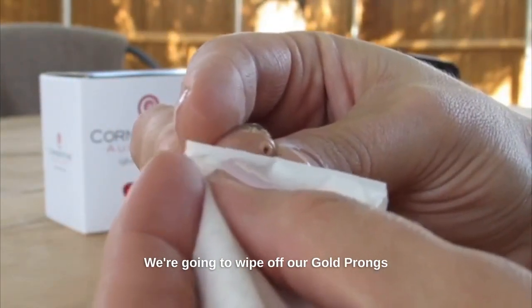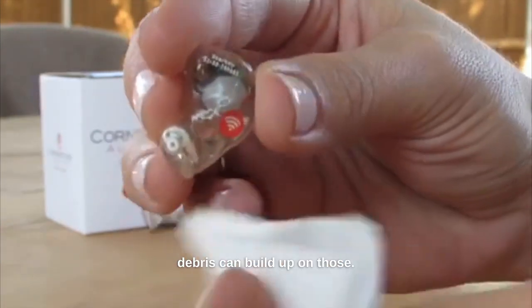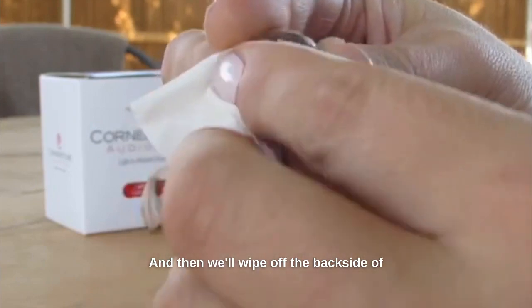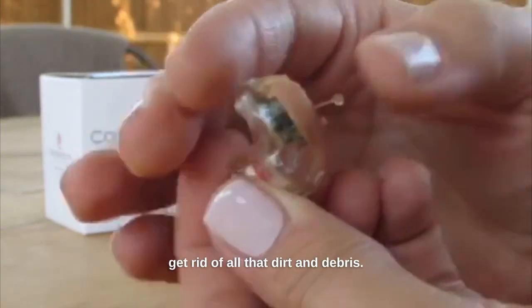We're going to wipe off our gold prongs to help with charging, because sometimes dirt and debris can build up on those. And then we'll wipe off the back side of our hearing aid and make sure that we get rid of all that dirt and debris.